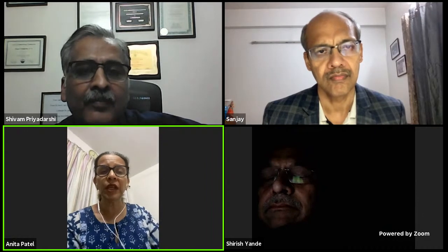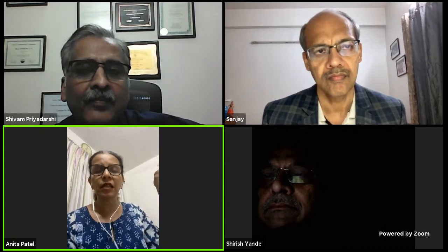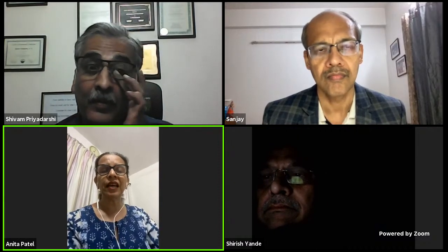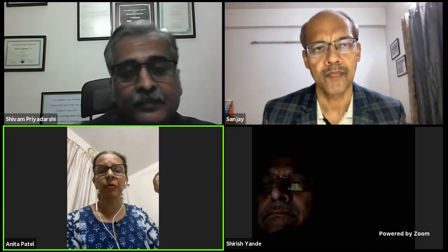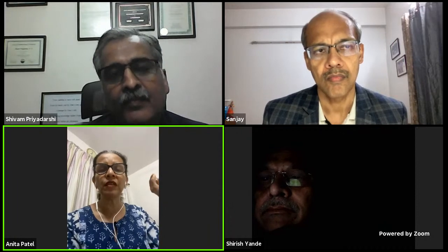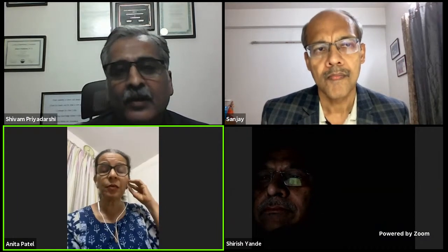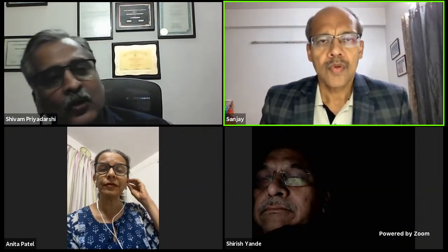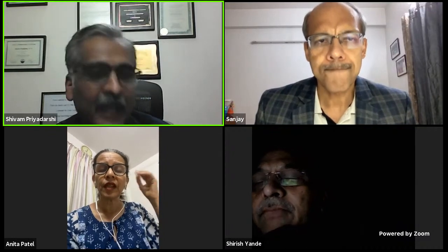If it is known to me, and if I know I don't have access to a video, I will insist on a pre-procedure MCU. I think that's the best that I can answer it, so that I make sense out of my urodynamic trace by marrying my trace to the previously available MCU findings. That's the best that I could answer it. So if you do not have a video, at least have a pre-urodynamics MCU.